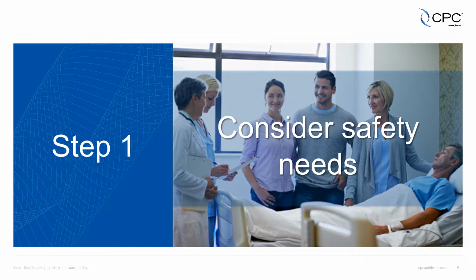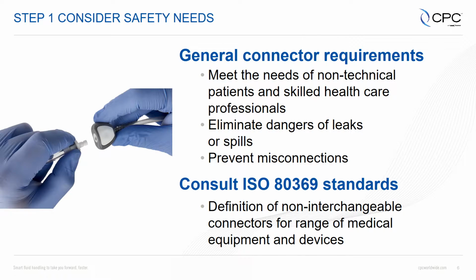Our first step involves looking at some of the general requirements to ensure that we consider basic patient safety. First, we want to make sure that we look at it from a general sense. We want to meet the needs of both non-technical patients and skilled healthcare professionals. And this really relates to usability, as we see a trend to more home healthcare applications where non-technical or non-trained people are administering care. It's very important that the connector is obvious and easy to use to make sure that the care is administered properly.